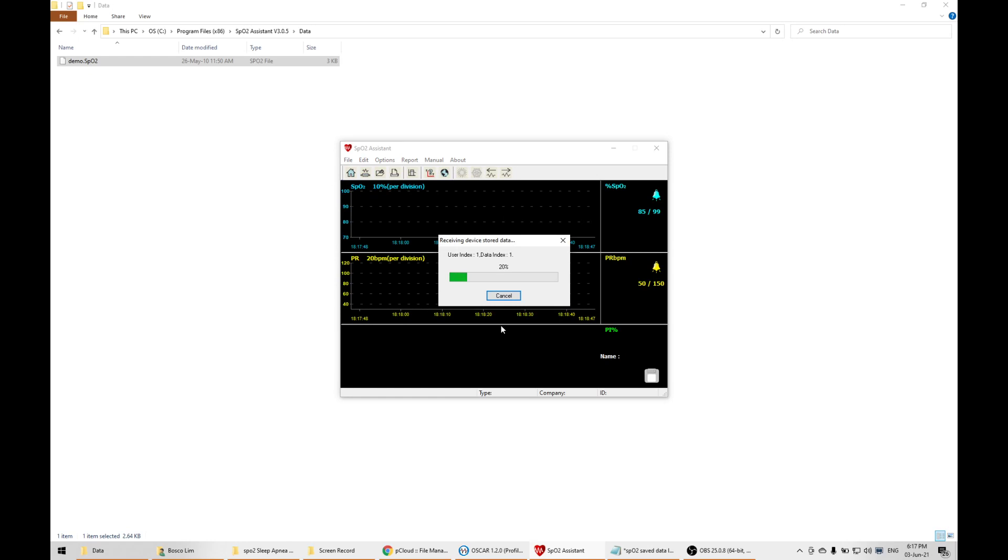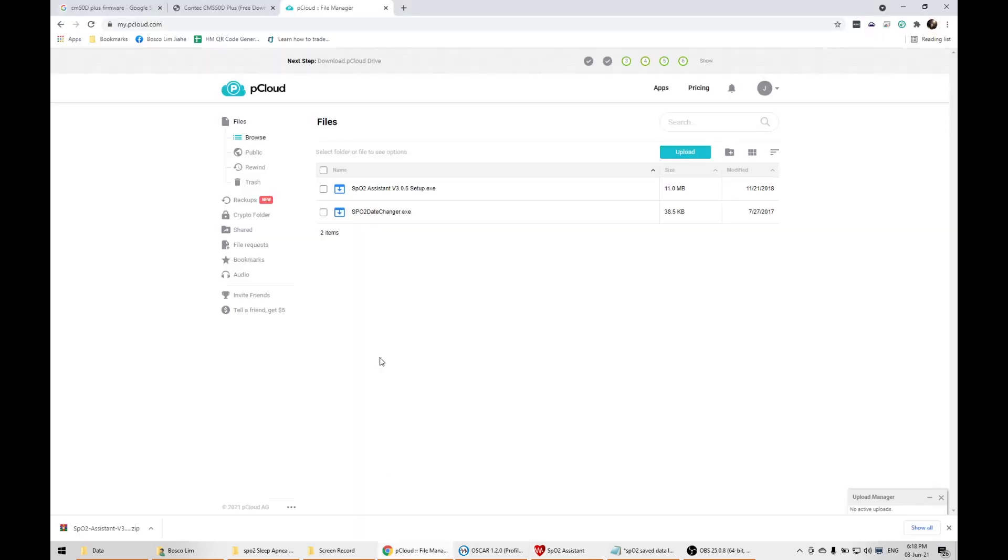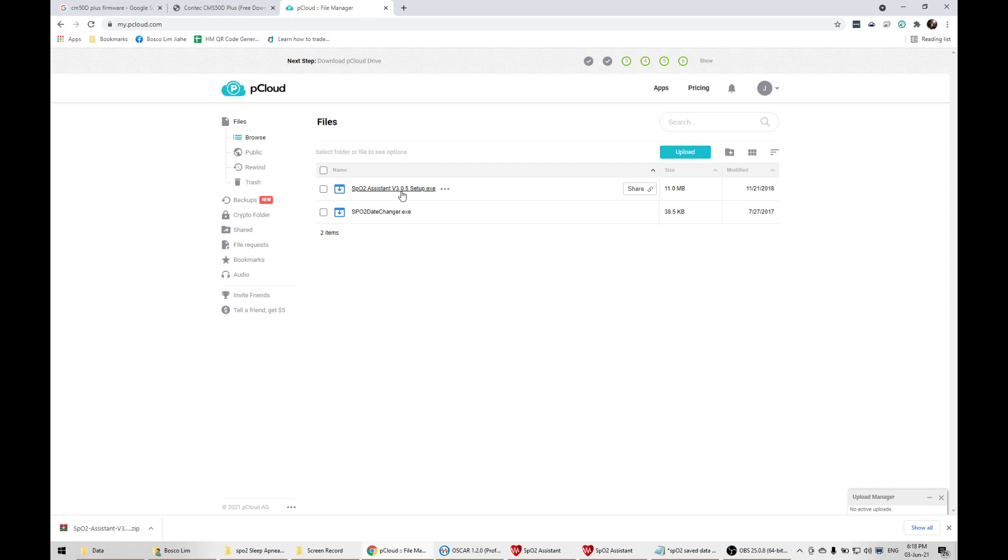Once you click connect and receive the data, this will take some time. I'm going to import fresh new data so I can repeat the process and guide you through exactly. I'll also upload links to files I found online, including the latest SPO2 assistant version 3.05. Hopefully when new versions come out, someone will share them.